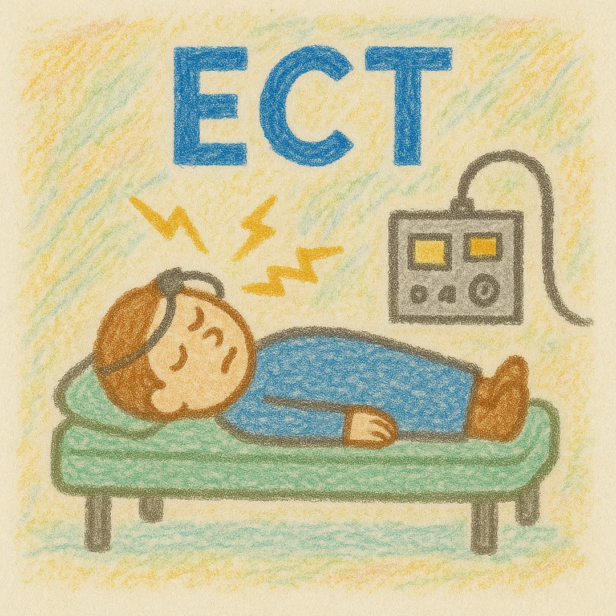You might increase the dose or make some other changes, like seeing if you could lower the anesthesia to get a longer seizure. There is not a sort of linear relationship between the length of the seizure and the clinical outcome, however. It's not that every additional second that you get a seizure going is going to be an extra point lower on the PHQ-9 or something like that. It's really just, are you getting a robust enough seizure or not? If it's really short, it may not be effective, but the difference between 30 seconds and 50 seconds is, as far as we know, not very clinically meaningful.